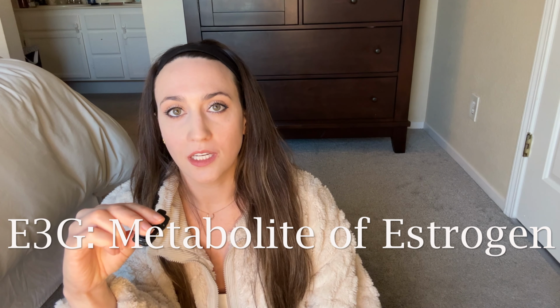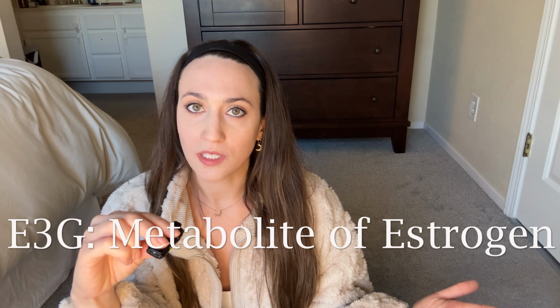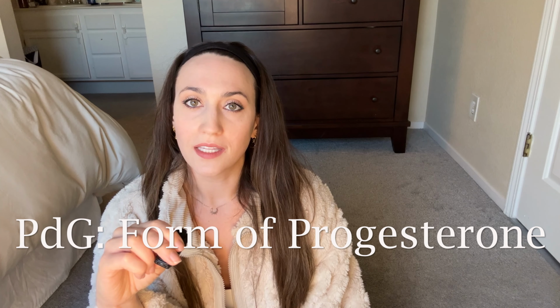The next hormone is E3G. That is a metabolite of estrogen that is found in the urine. Now, what that is telling us is kind of what our fertile window is. That time frame for our fertile window usually is about 6 days. According to Mira, that hormone is helping us determine what those 6 days are. The next hormone that we're looking at is PDG, and that is a form of progesterone that is found in the urine, and that helps us to confirm that ovulation has actually occurred.